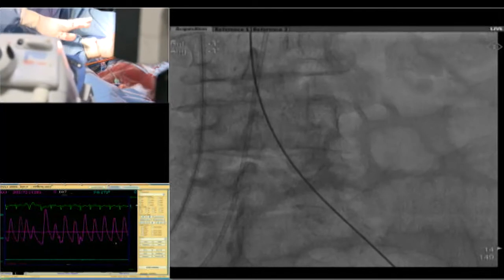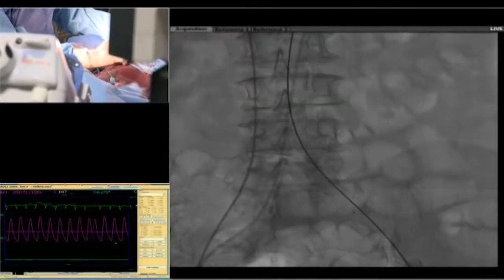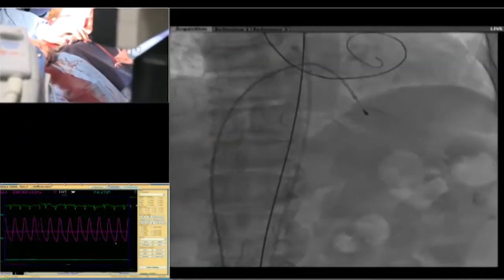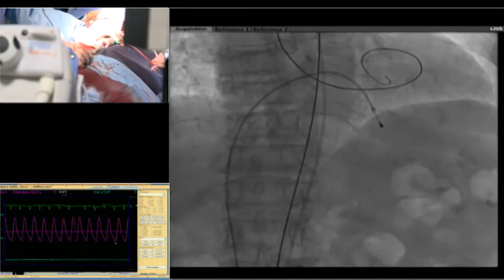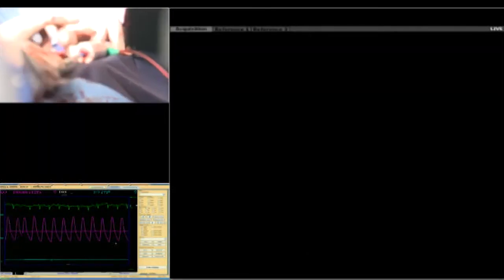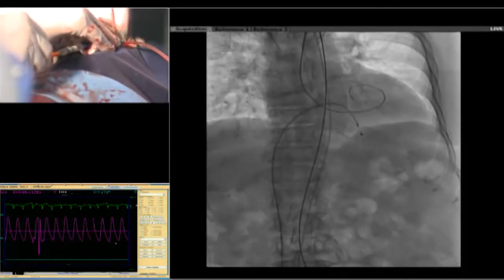Yeah. So what you have to do is let's see the pigtail inside. Show us the LV wire. That's it. Show us the wire in the LV. LV wire. Go 48 mag. Yeah, that's good. Less mag. So now the wire is very important, so we have to release this again, right? Okay, so yeah, you'll have to release this fully.